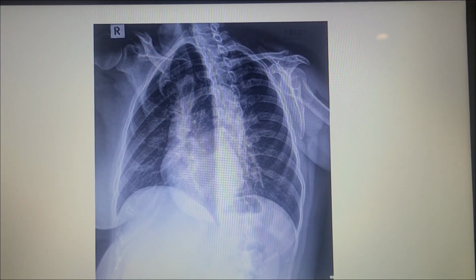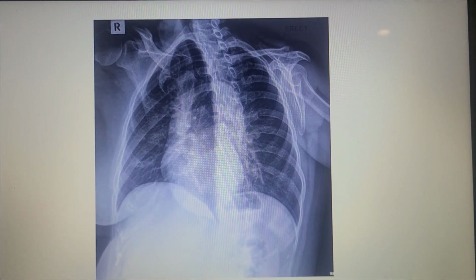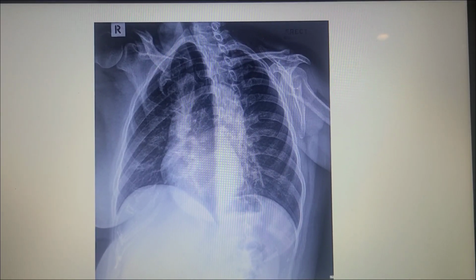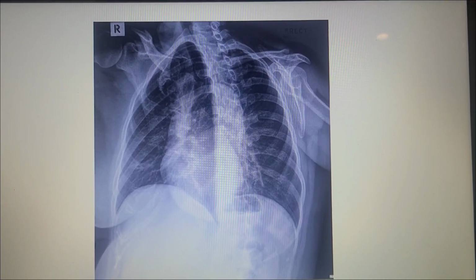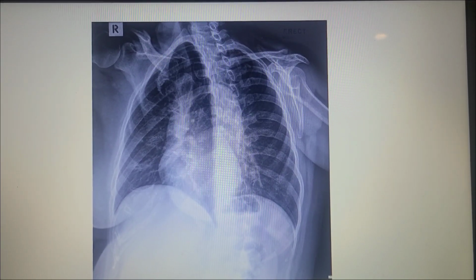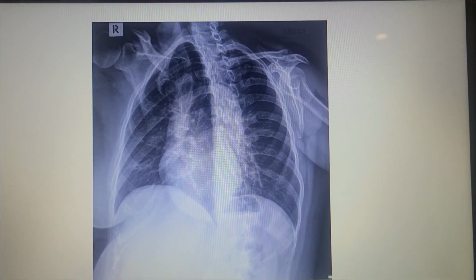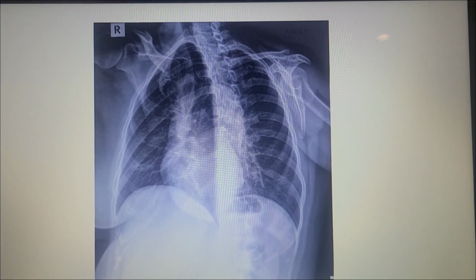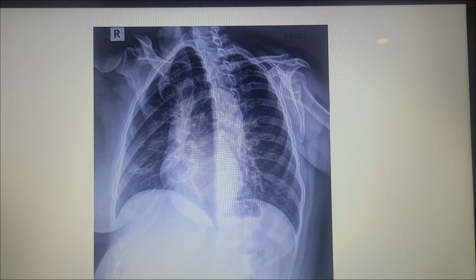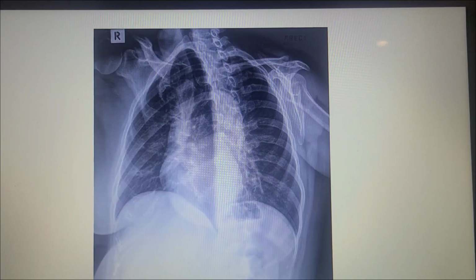Lastly, our oblique projections show our axillary ribs free of superimposition of the thoracic vertebra. It can be difficult to tell if you have under or over obliqued your patient when taking these exposures. However, an easy way to tell you have proper patient angle is to examine their shoulders. On one side, you'll see a Grashey, and on the other, you'll see a perfectly lateral scapula or a scapular Y view. You'll also notice approximately twice as much distance between the vertebral column and the lateral border on the affected side as on the unaffected side.